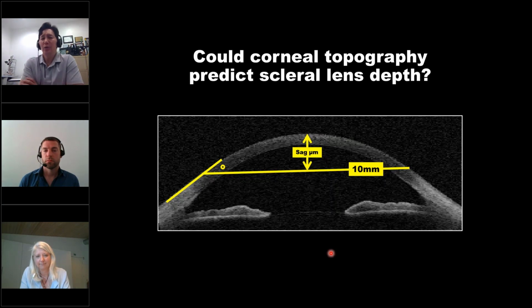But I don't know if the Medmont topographer can give us a really good appreciation of the type of shape the sclera has. I think it gives us a good understanding of the predicted depth that we might need, but trying to use it to say, yes, we definitely have an asymmetric scleral shape or a symmetric scleral shape, I think that's asking a lot of the instrument.